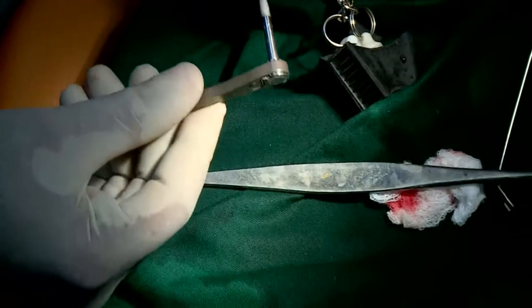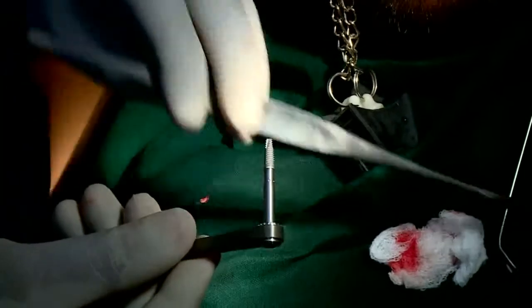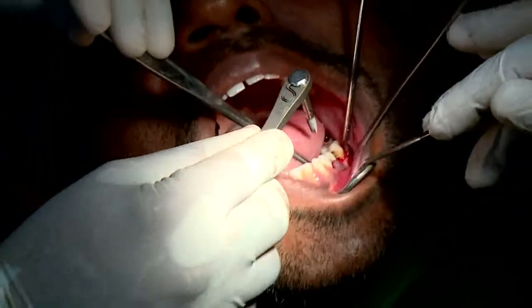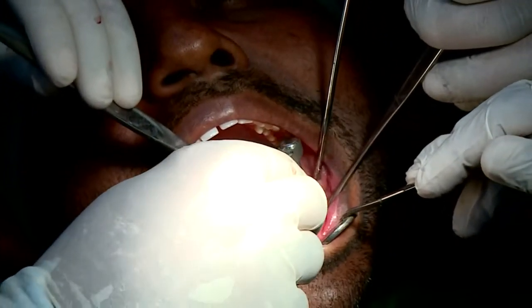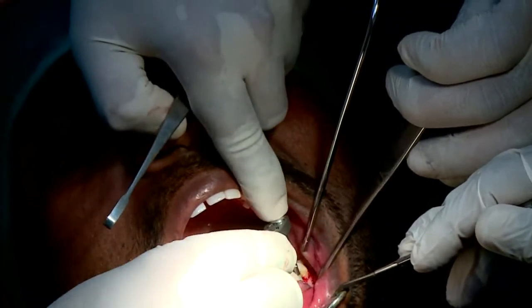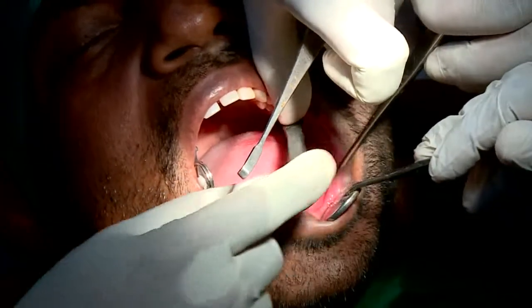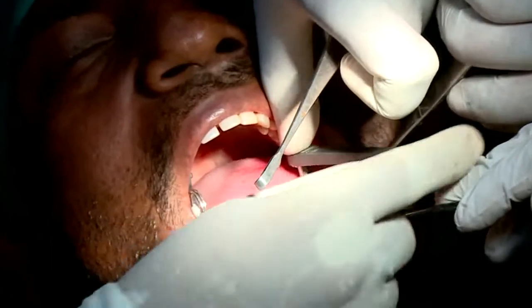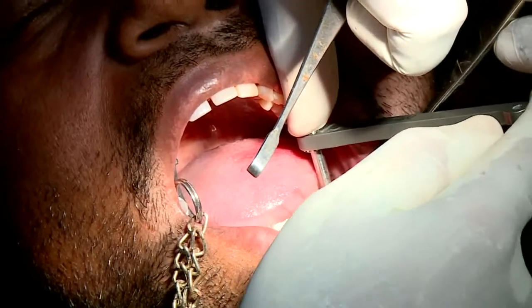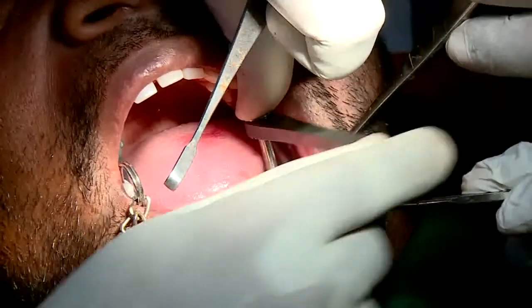So now what we are going to do is, at this particular time, you try not to touch any other metal surface. Can we readjust the light? Try not to touch any other metal surface. So I am just placing the implant there. And then the important thing about it, so I am tightening and the implant is freely moving in. As you see, I am loosening it up, nothing happens. I am tightening, it goes inside.